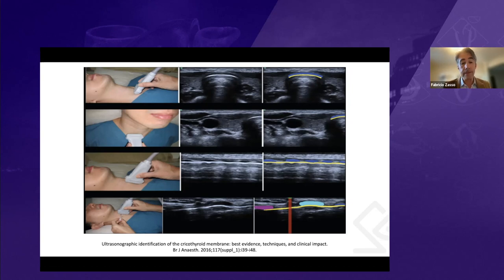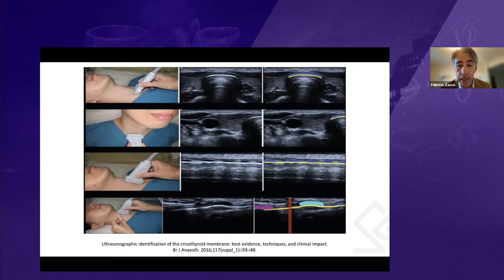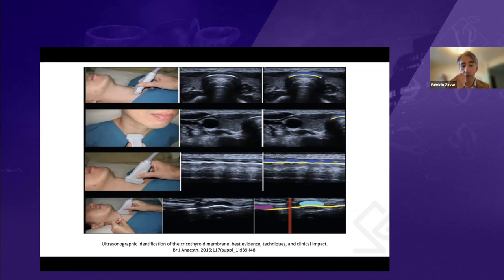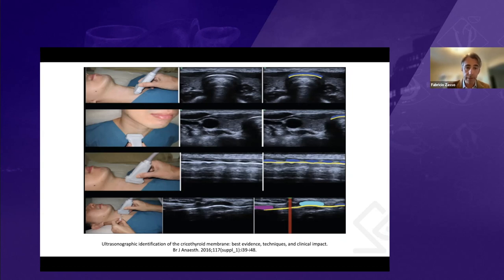In general, the longitudinal technique is more accurate, but it's ideal to have proficiency in both. If the patient has a very short neck or if the midline is distorted, the TACA transverse approach will be the best option to use.